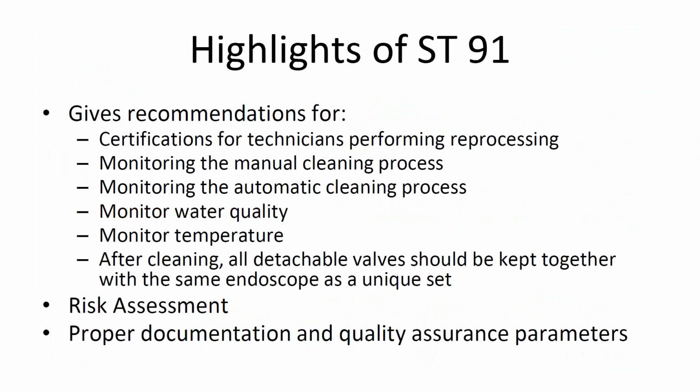interval for your endoscopes. And then there is also information in there on proper documentation for each category, so what you should be documenting during cleaning or during leak testing, and how to build quality into each of those different categories. Next slide, please.